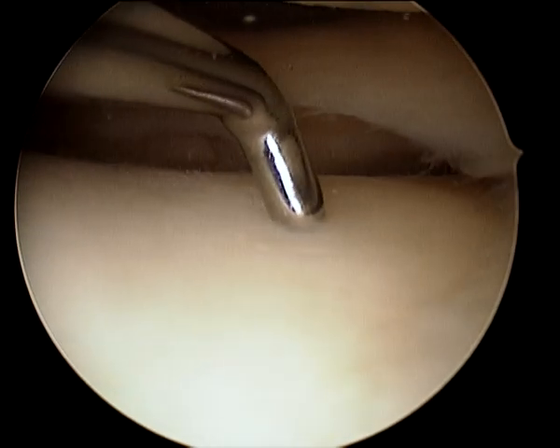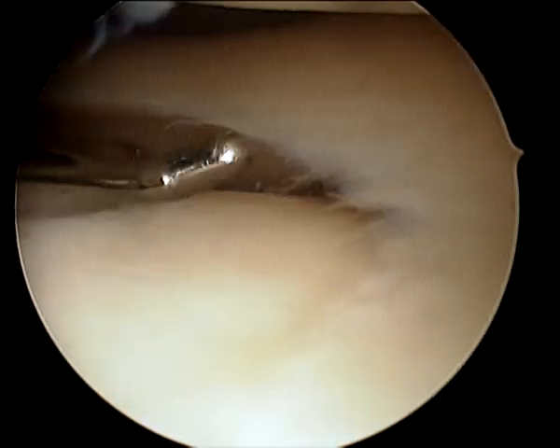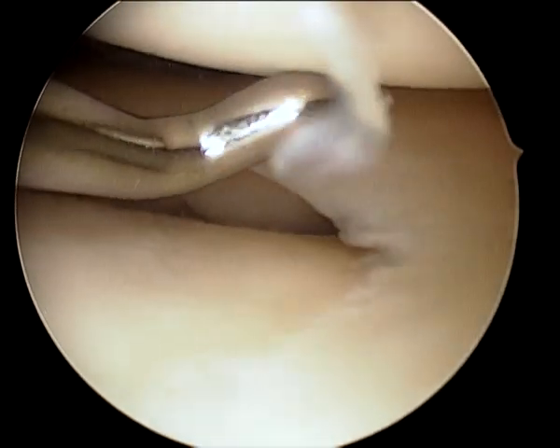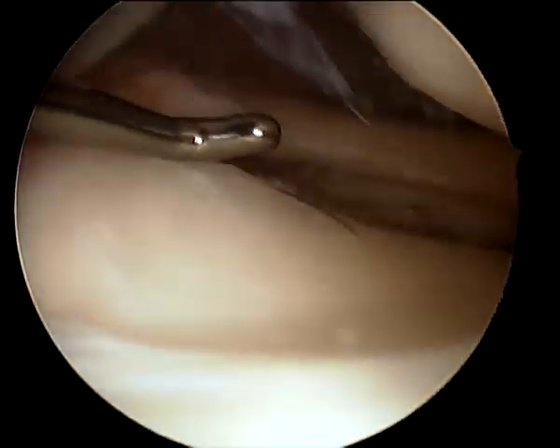So a bit of recording time. This is the tibia on the outer aspect of the knee. This is a normal lateral or outer shock absorber. And this is the femur on the outer aspect of the knee. That all looks beautiful. No problems at all.